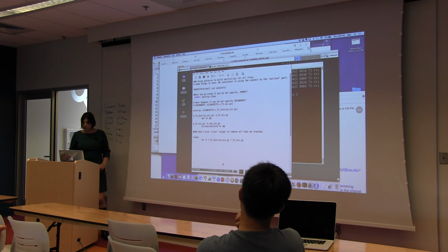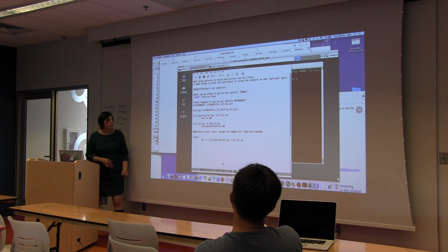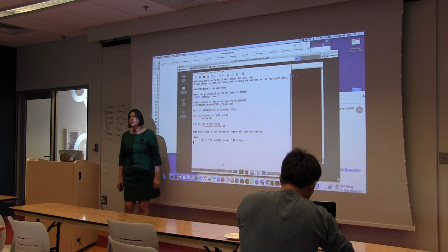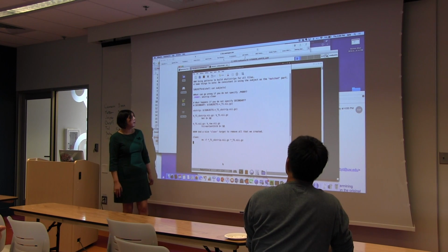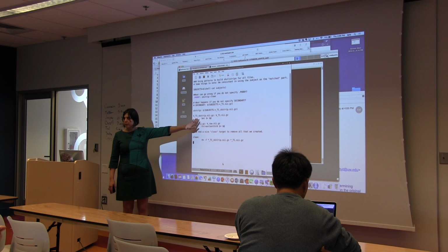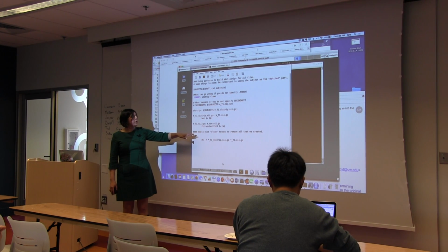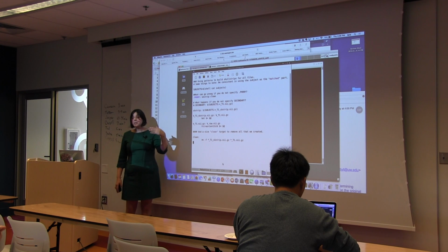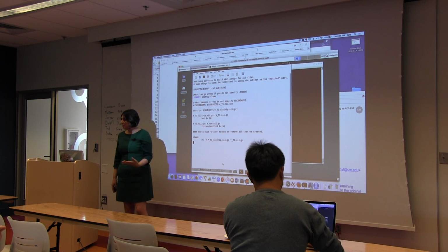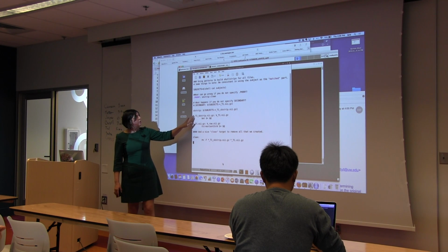I commented this out, right? So here, this is one of the more complicated and subtle things about make. When you match patterns like this, what happens is that this can be a desired effect or not desired effect. It depends what you want. Notice that what we're trying to create are the skull stripped images.